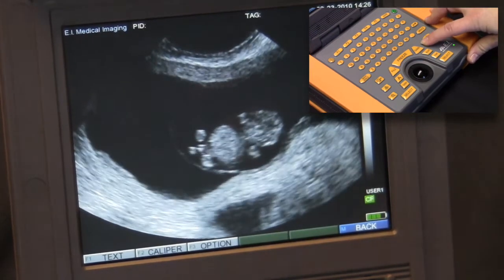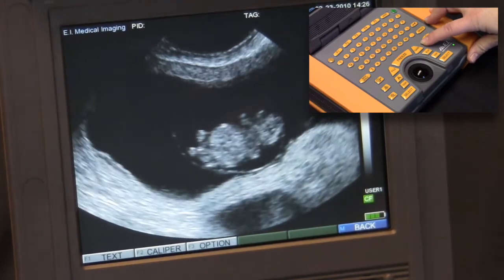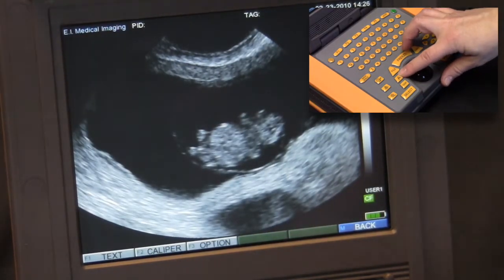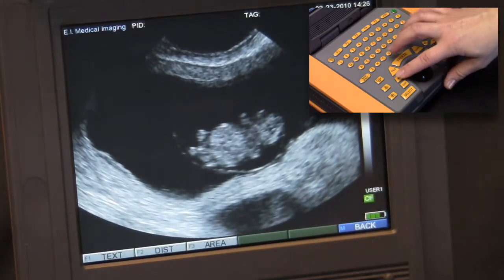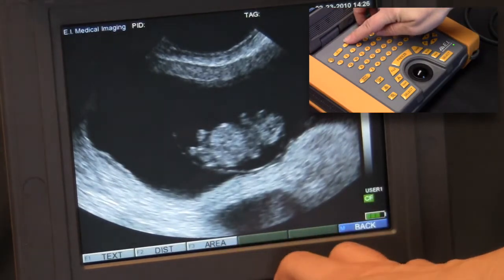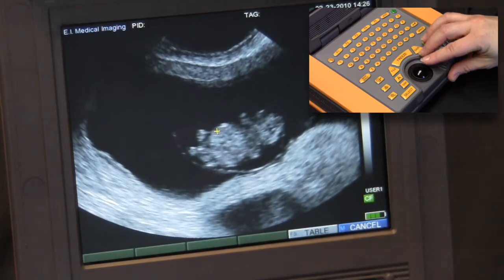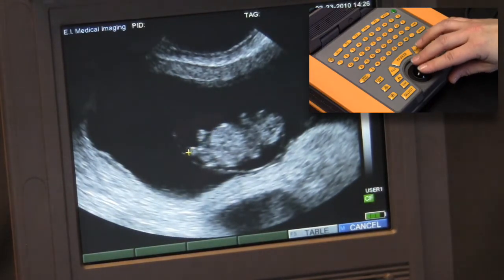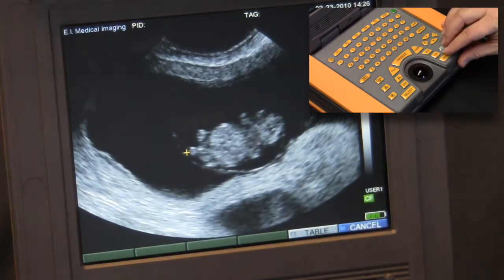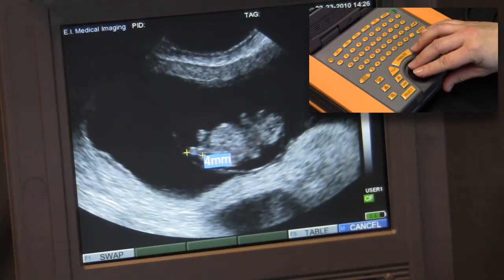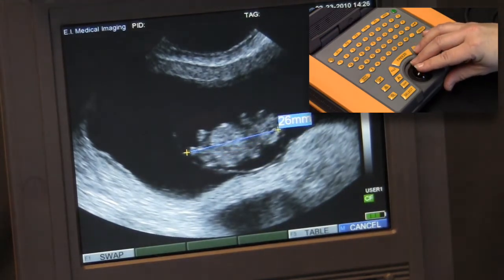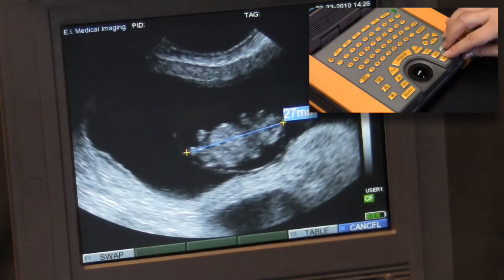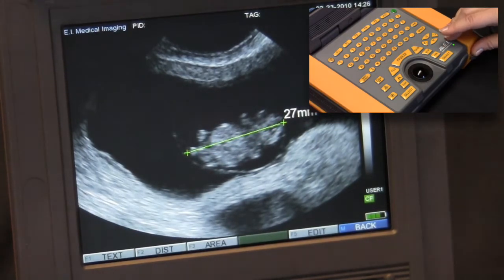Next I will select the caliper button to the left of the trackball and then F2 for a distance or linear measurement. That will bring up a cursor on the screen. The trackball is used to move the cursor to the starting point. The select key begins the measurement and the trackball is again used to draw a straight line. Press select once again to commit the measurement.